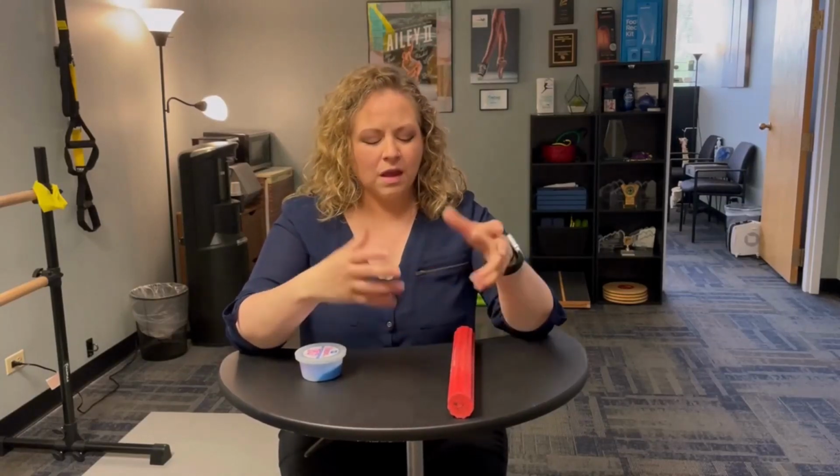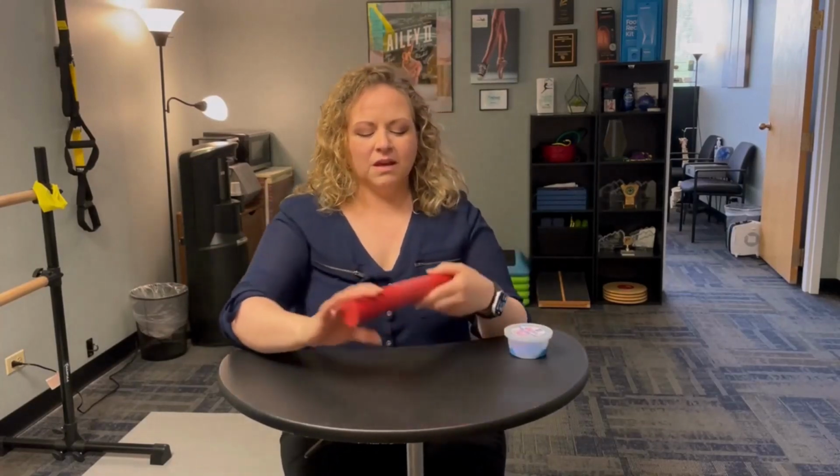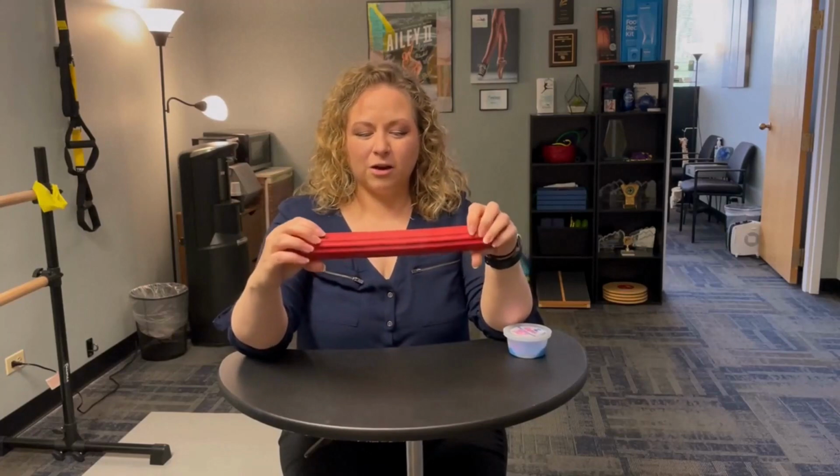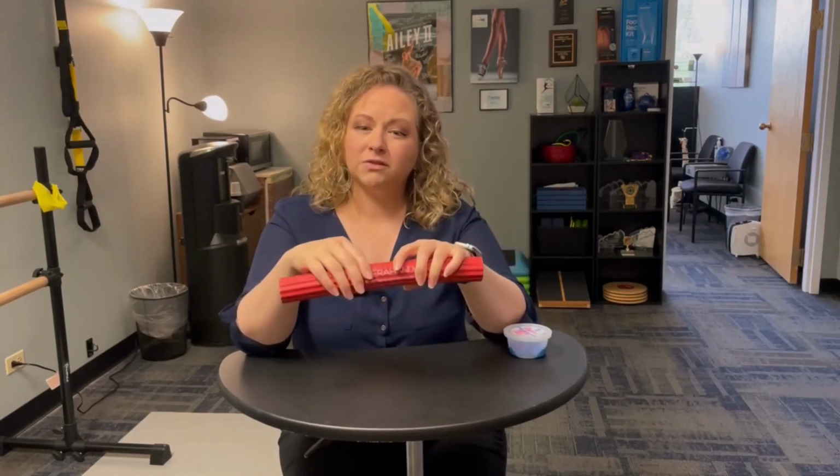When it comes to building hand and wrist strength, there are lots of different things that we can do. Here are a couple of ideas. First of all, this is called a TheraBand Flex Bar. There's some different options like this. They come in different strengths.